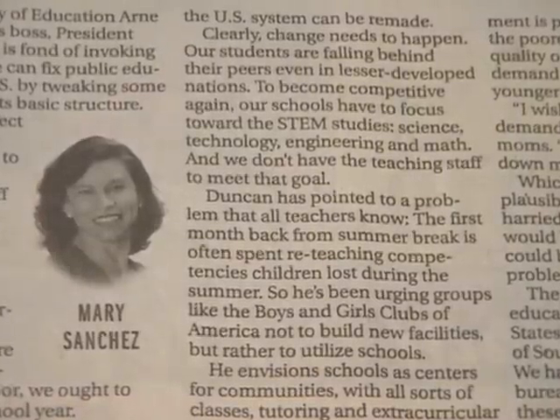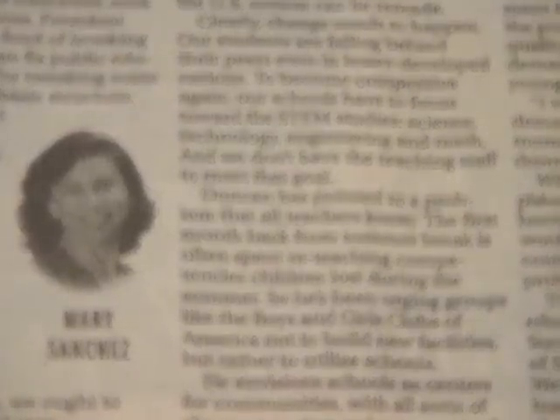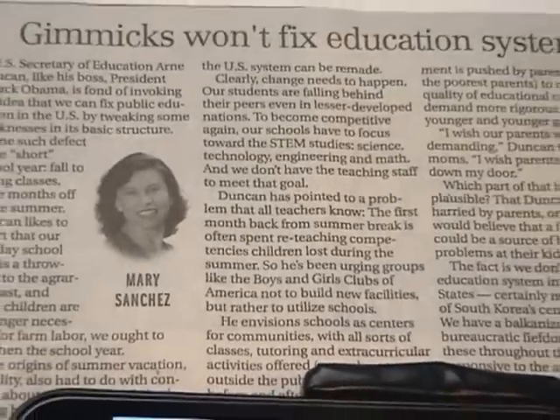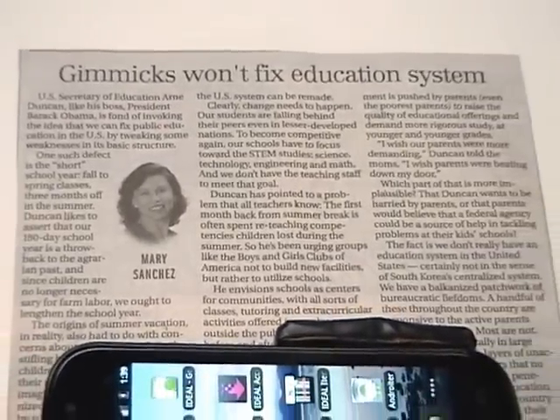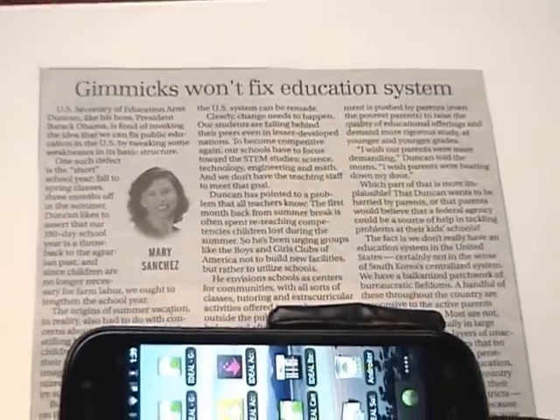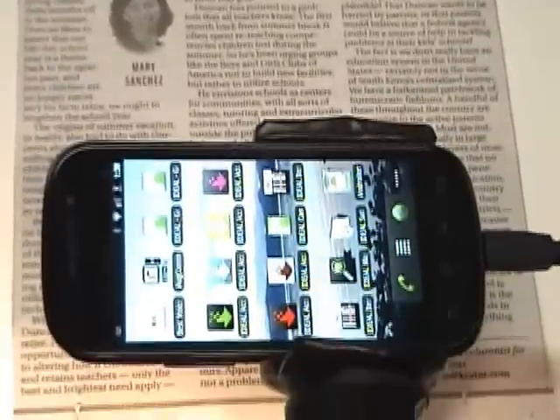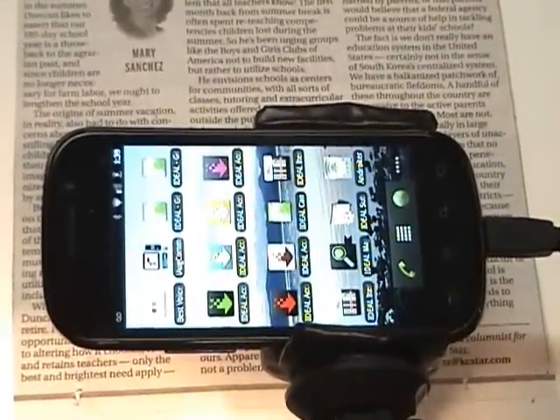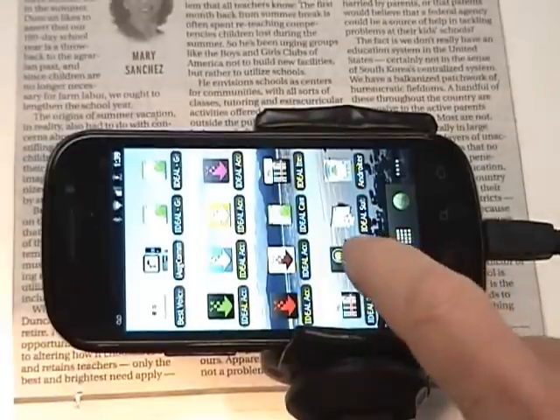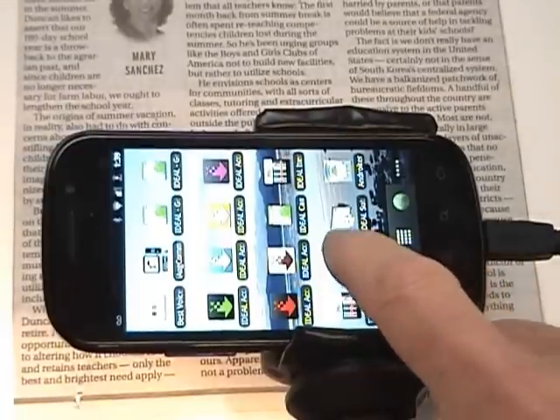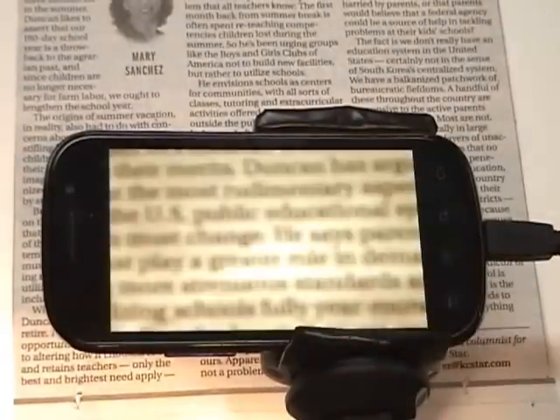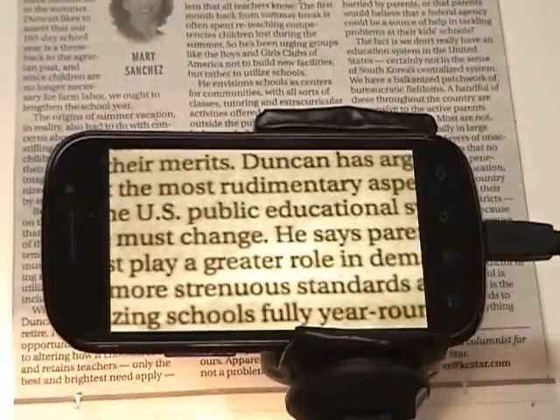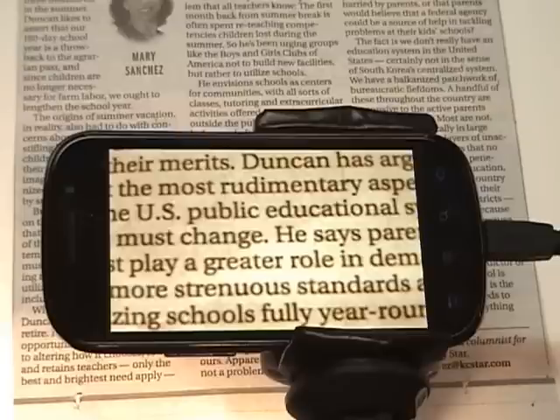We're looking at a newspaper. I'll pan the camera back a little bit and we will see a Nexus S smartphone in a little holder over the newspaper.